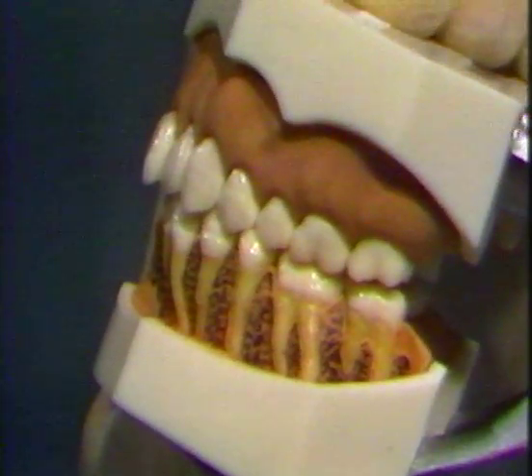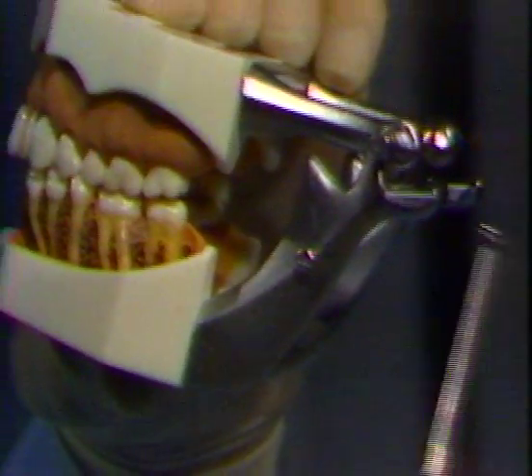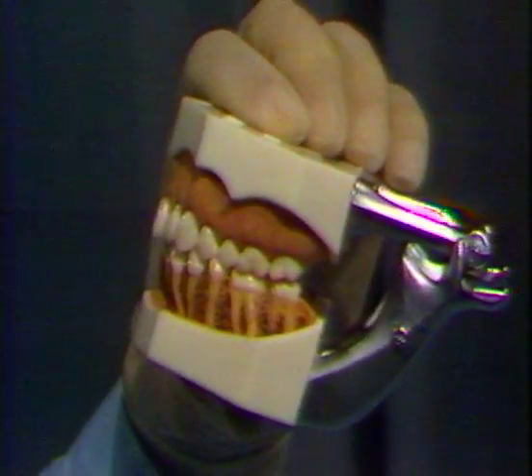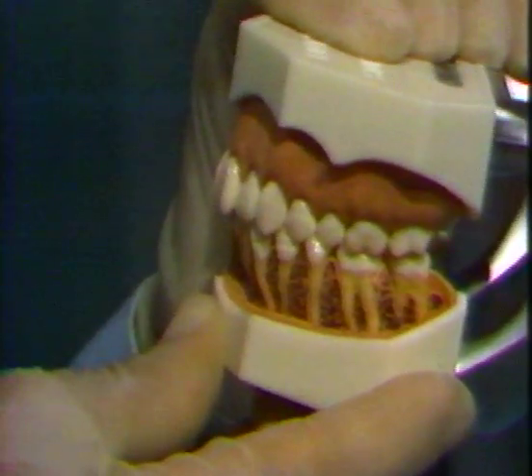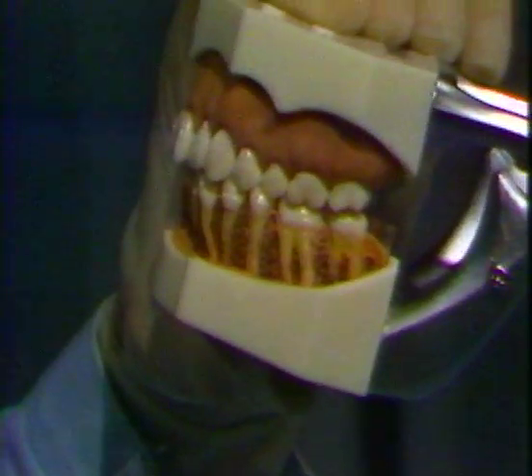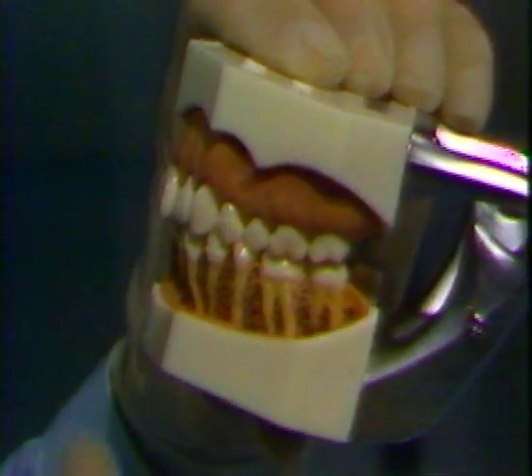Also, the mandible pivots on two hinges, the condyles, which are attached to the skull by tendons, muscles, and ligaments. Consequently, the mandible must be supported during extraction movements to avoid undue stress being placed on the soft tissues supporting the mandible. As previously indicated, in multiple tooth removal procedures in one quadrant, start with the most posterior tooth and work toward the anterior teeth.